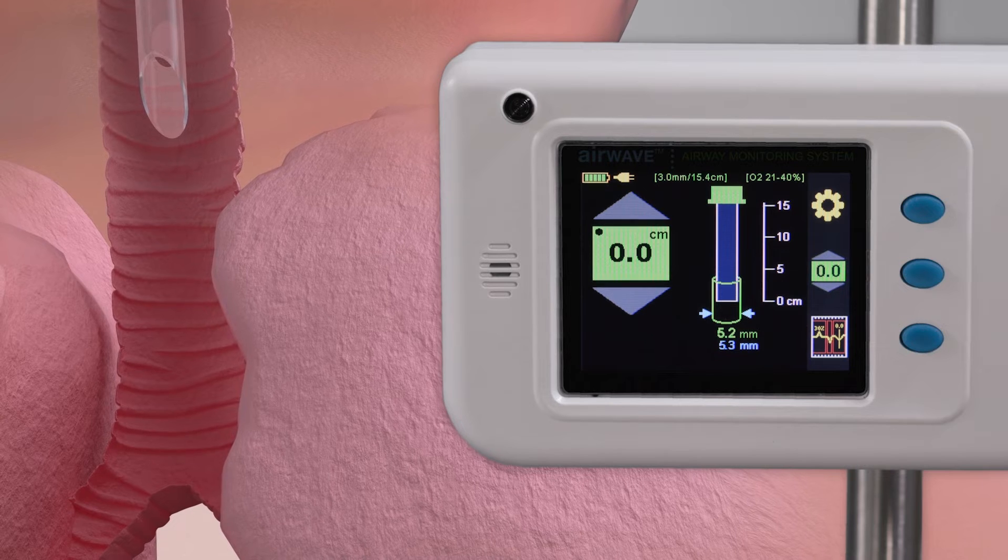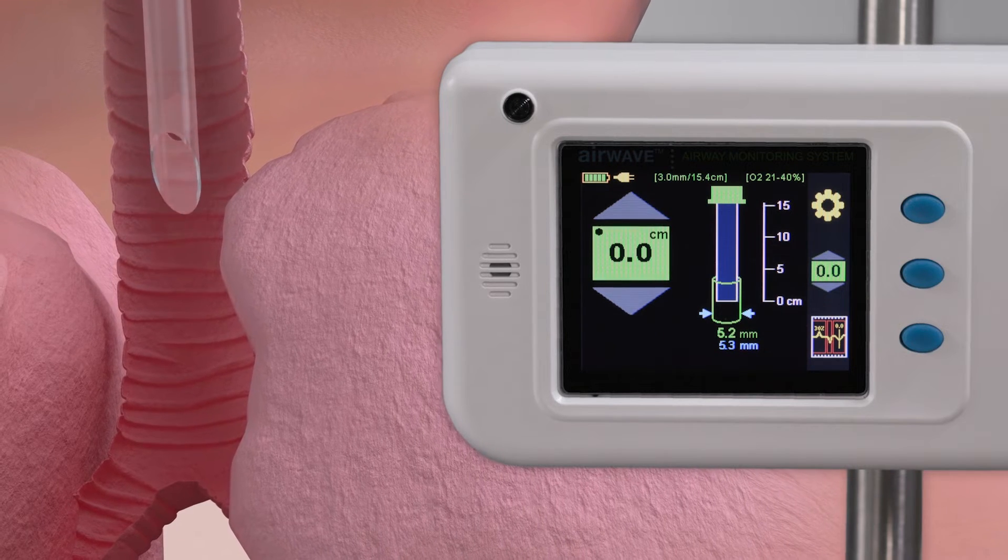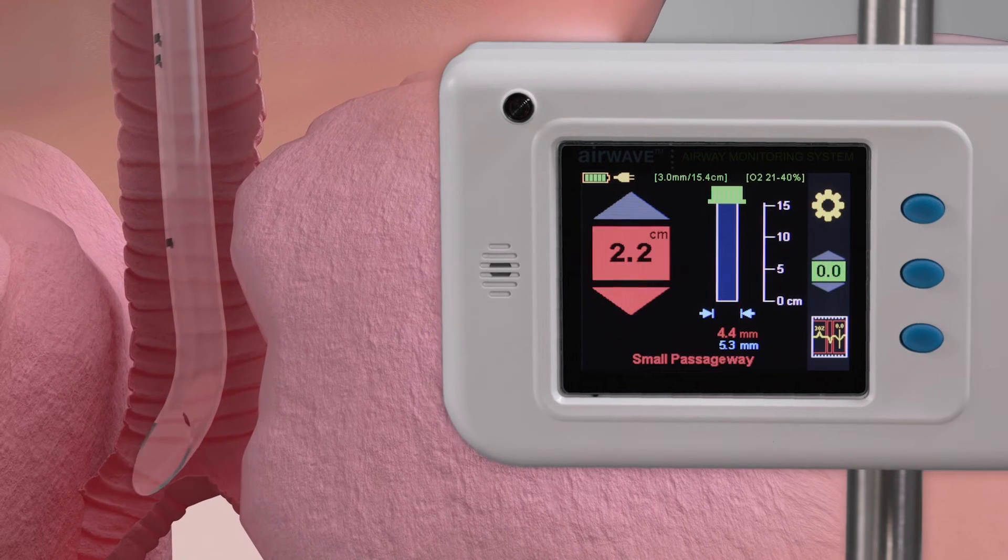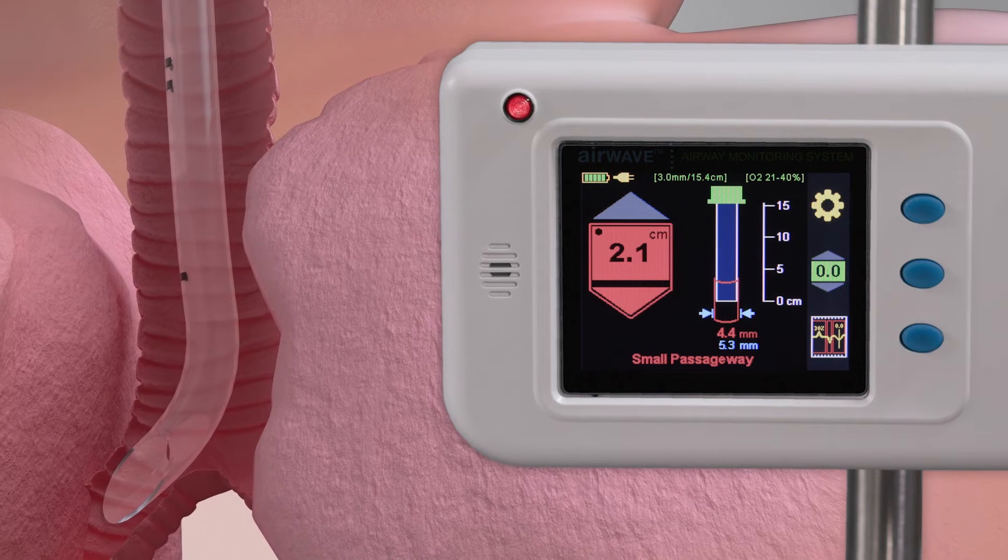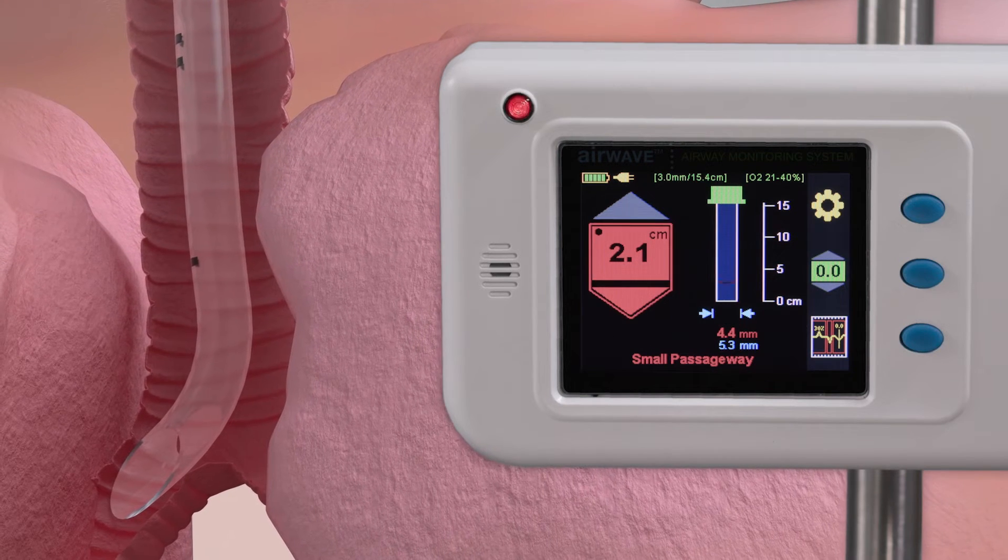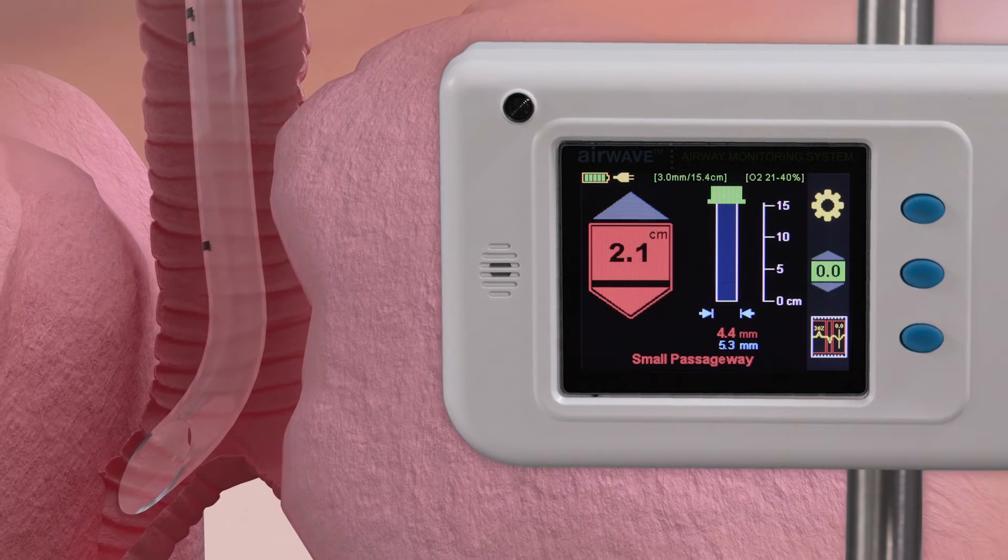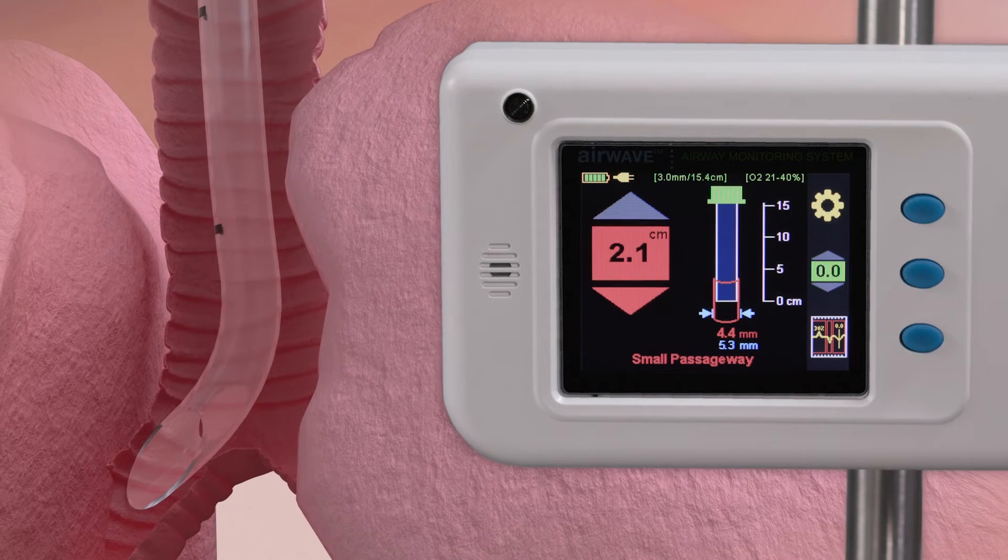The second continuous measure is the circumference of the patient's trachea at the tip of the endotracheal tube. This allows you to receive a notification if the tube has entered a smaller passageway, such as the right main bronchial stem.